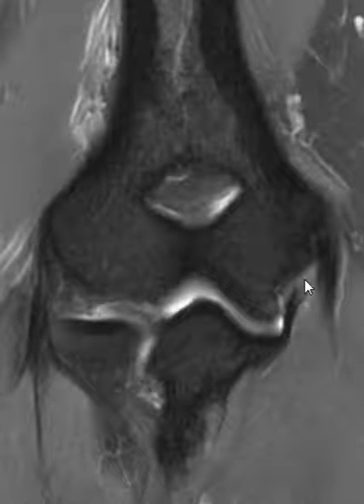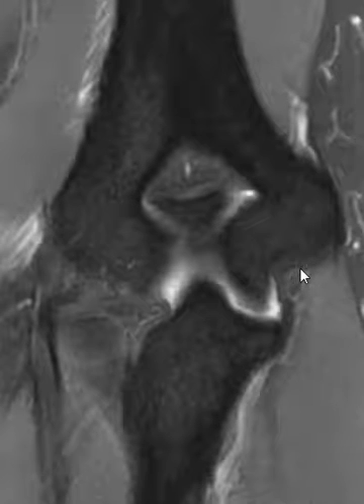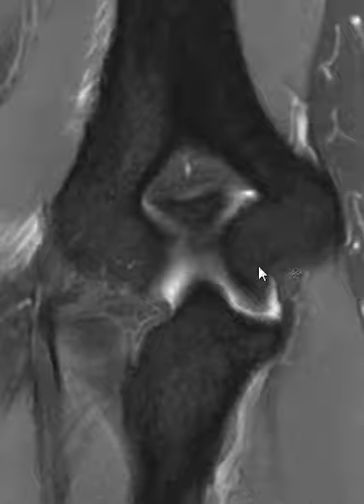Now if we follow this up in this patient, there's fogginess where it attaches to the humerus. There is the posterior band of the medial ulnar collateral ligament — there are two bands. This is the posterior one, where there's a horizontal ledge. Usually it's ill-defined, and this one again is ill-defined, maybe partially torn.